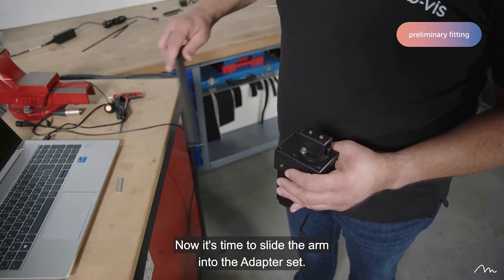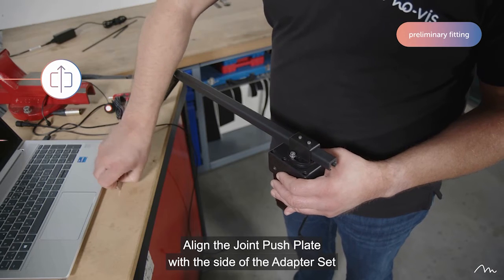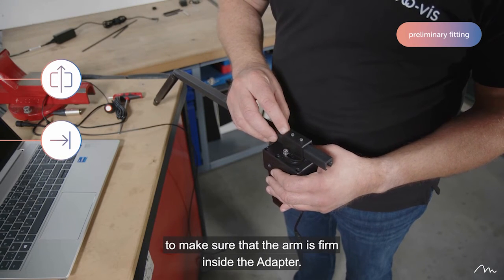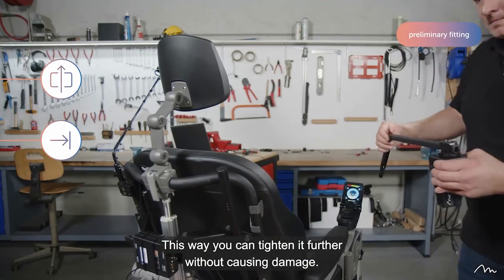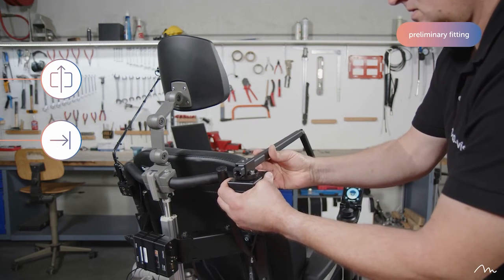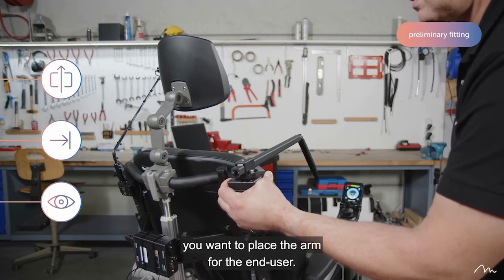Now it's time to slide the arm into the adapter set. Align the joint push plate with the side of the adapter set to make sure that the arm is firm inside the adapter. This way, you can tighten it further without causing damage. Check visually how you want to place the arm for the end user.